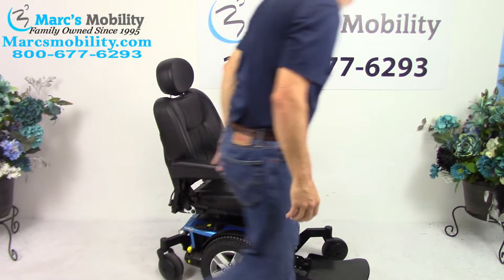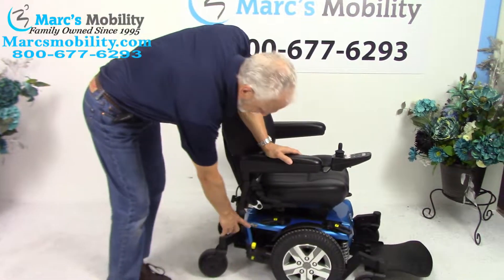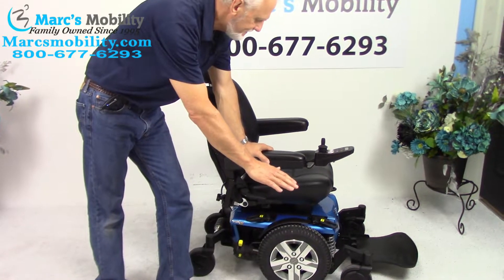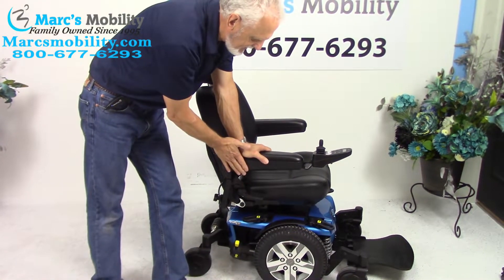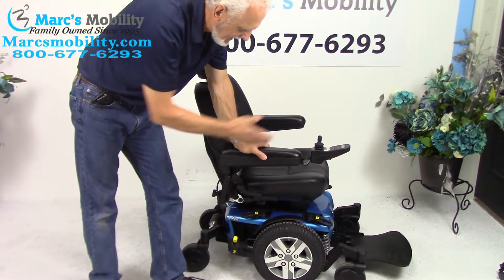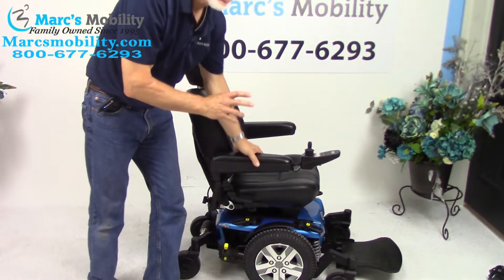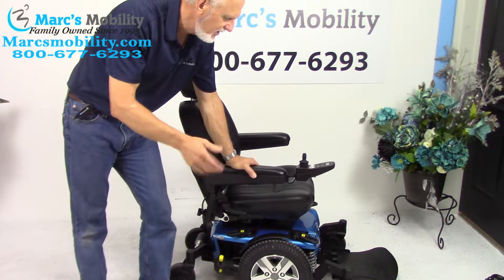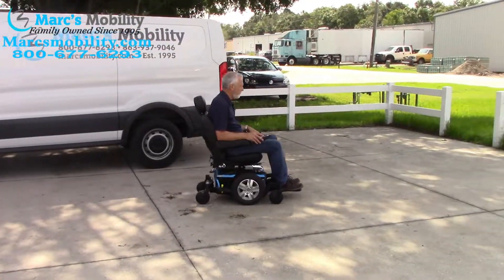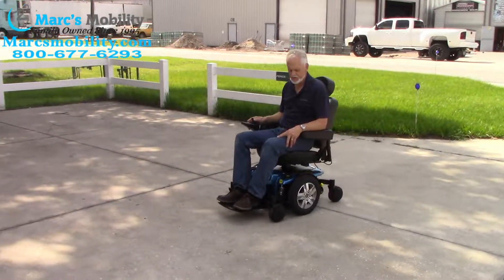So let's recap. This is a Quantum Edge 2.0 power chair — used for about two to three months. It has the six-inch seat lift, the captain seat, solid tires, the famous Quantum suspension, anchor points, the larger foot plate, and the safety belt. Just a nice power chair — if you need a power chair with a seat lift, this would be a really, really nice one.